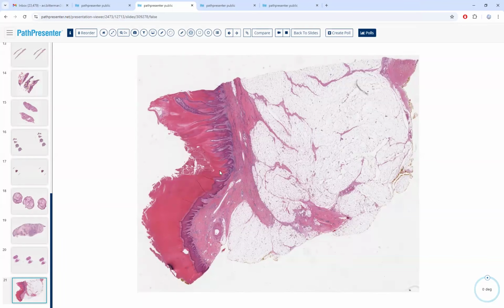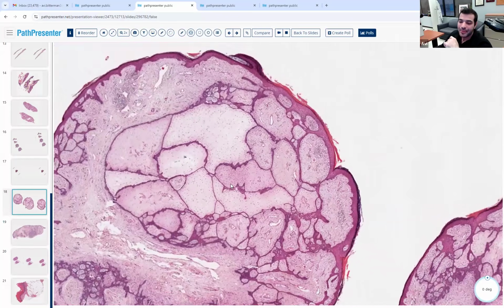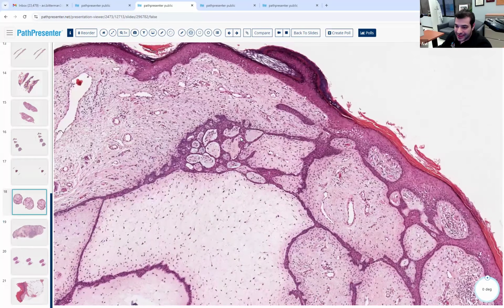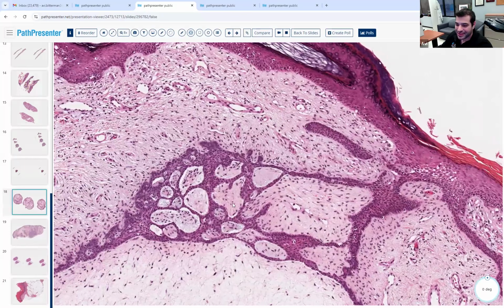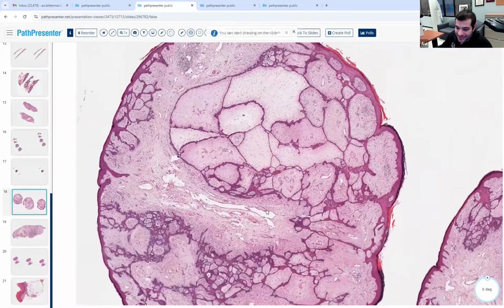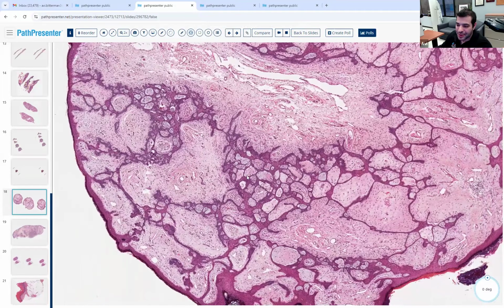Sorry, Avi, what was the answer to that last one? They said pincus. They're correct. That was a fibroepithelioma of Pinkus, also part of your pink strands, blue buds differential. You can even see that here. Here's the pink strands anastomosing, and when they bud, notice how the buds are a little bit bluer, and you can even see some palisading reminiscent of basal. But it's different. The stroma is more fibrotic, and look how interlocking, look how anastomosing those strands are.